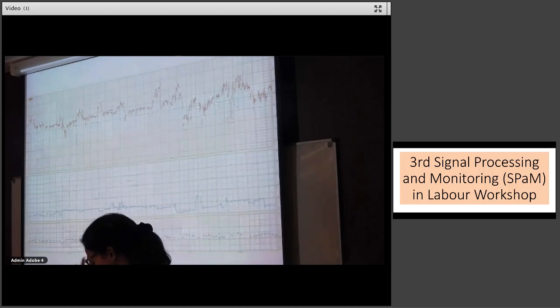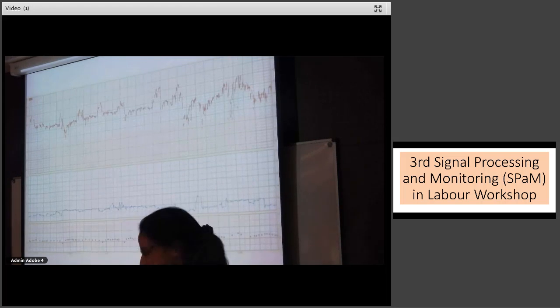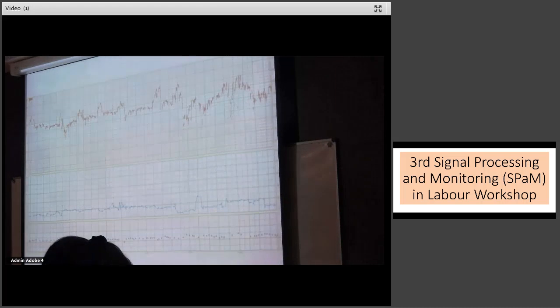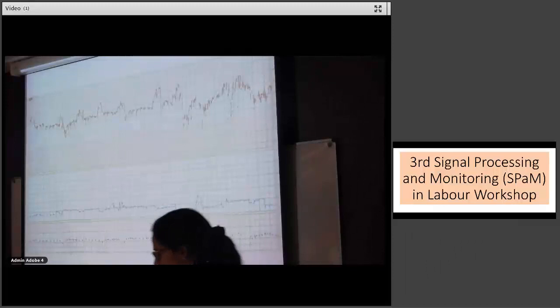It was something like 94% when I left 3 years ago. And the temperatures are hot. Yes. Not like in London. No, it is also hot in London. Sometimes. So we have a lot of maternal temperatures that go up. Yes. Sometimes we don't measure for a long time, and the only signal we have is from the baby getting tachycardia. And if we revert that with the air conditioning and with the paracetamol, I'm not sure the paracetamol is needed, you get actually a normalization of the tracing. In this setting here in Portugal, we have a lot of those.